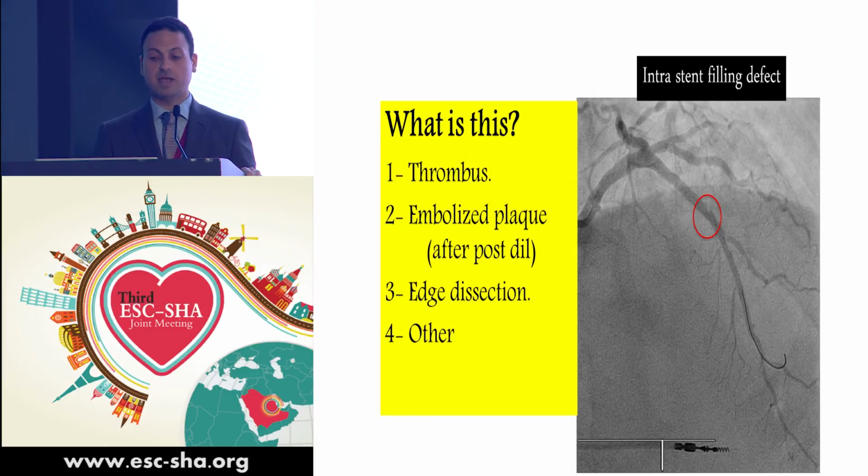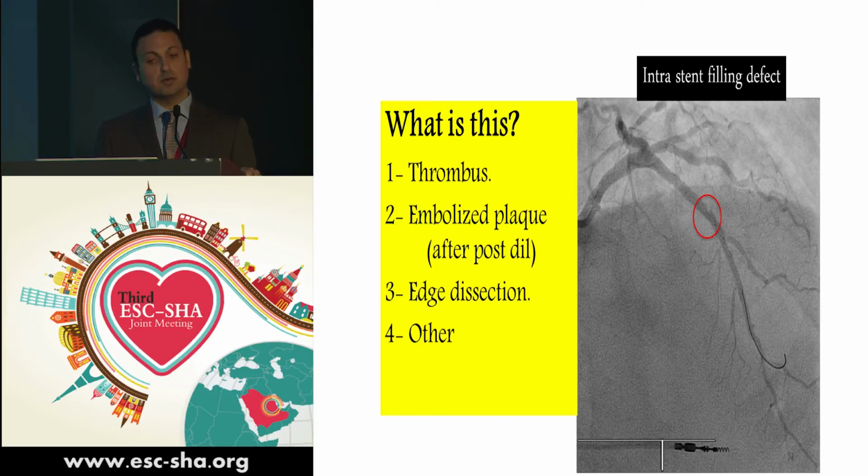Here, I'm having intra-stent filling defect. So what is this? Is this a thrombus, embolized plaque after post-dilatation, edge dissection, but this is not at the edge, it's inside the stent, or others. So coming to the answer, I'm going to OCT. Usually it gives me the answer.